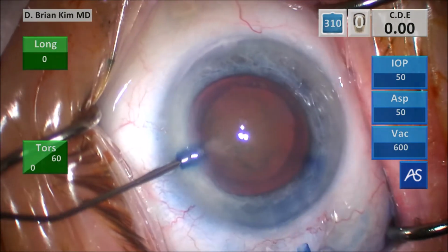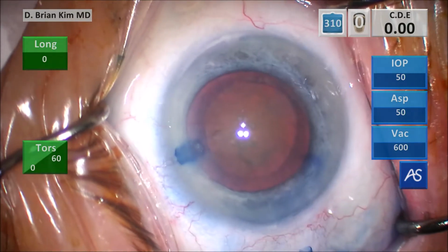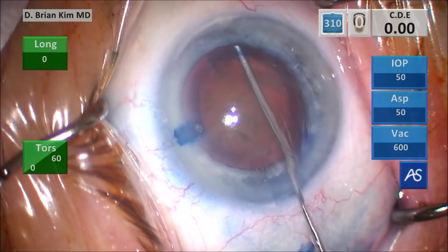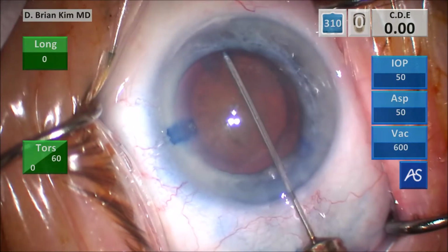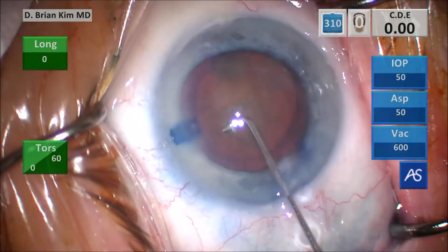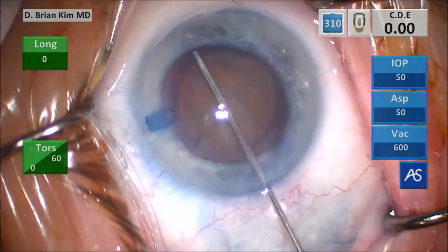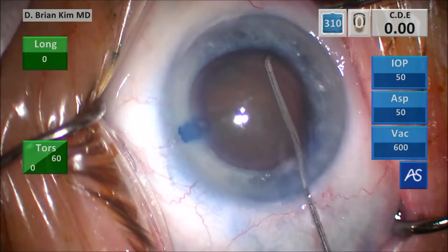And this is the capsular fornix hydrodissection technique. I'll place a cannula under the rhexis edge contra-incisionally, point the tip down. Get a nice wave, decompress on the left side, sweeping under the rhexis edge along the left side, and the lens begins to spin.